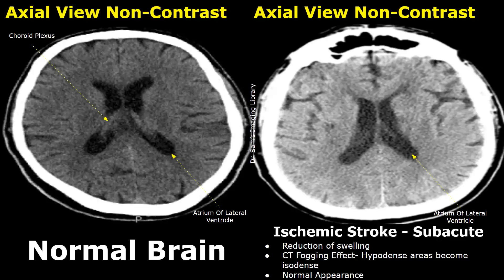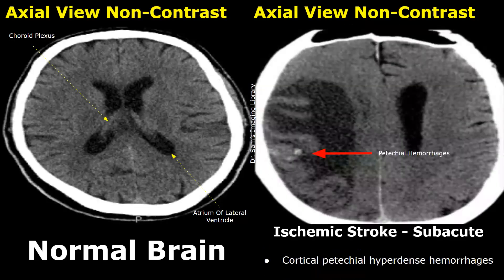In some cases of subacute ischemic stroke, petechial hemorrhages may be seen. These rounded, hyperdense small hemorrhages may be seen at the site of infarction.